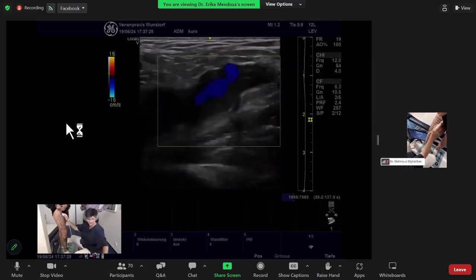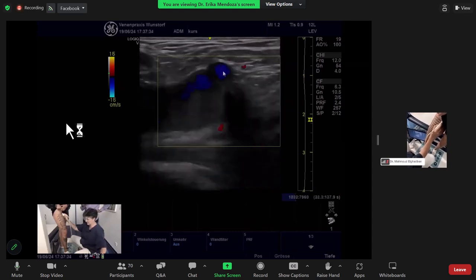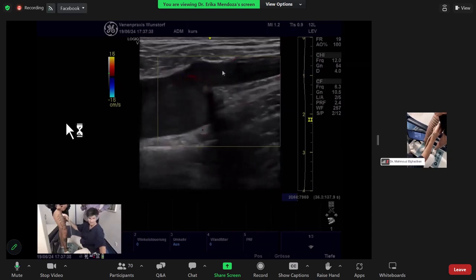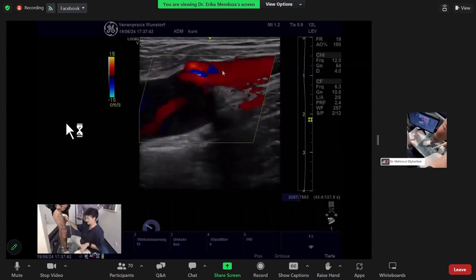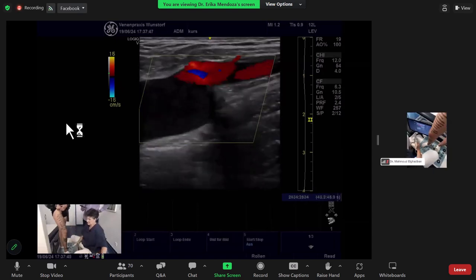Here you have the junction. This is the femoral vein, and this is the valve place. I like to put it all in one image. This is better. That's great. And now lower the end down, and you see very clearly that the reflux is not coming out from the deep vein.